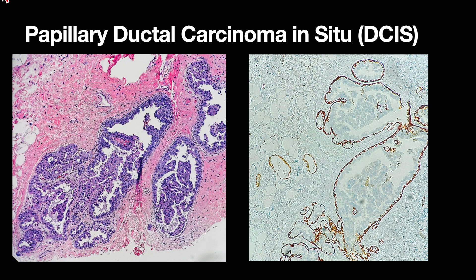Here we have DCIS with papillary architecture as well as some micropapillary architecture. A myoepithelial stain is done, and as you can see, the myoepithelial cells are retained in the periphery and are absent within the lesion. And here is the staining of the capillaries.